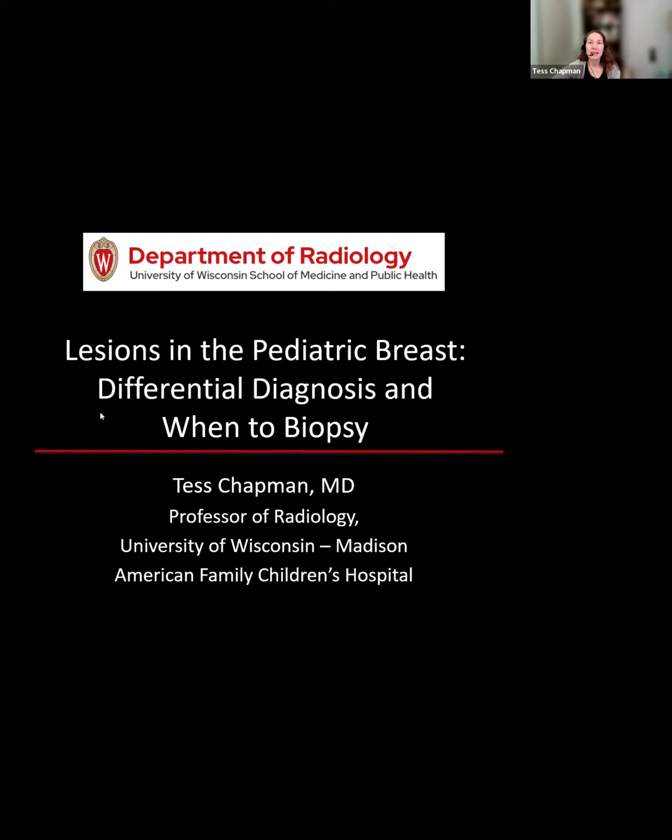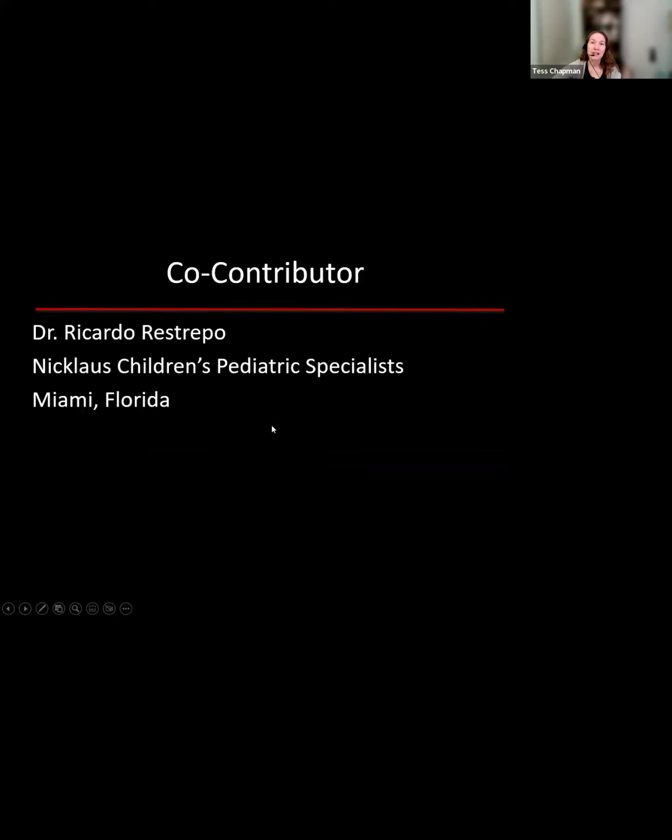So I'm going to be talking about lesions in the pediatric breast and how to diagnose them and when to biopsy them. First, to begin, I want to acknowledge one of my colleagues, Dr. Ricardo Restrepo from Miami, Florida. He gave me several wonderful cases that I have included in the presentation today, and so I want to thank Ricardo for that.